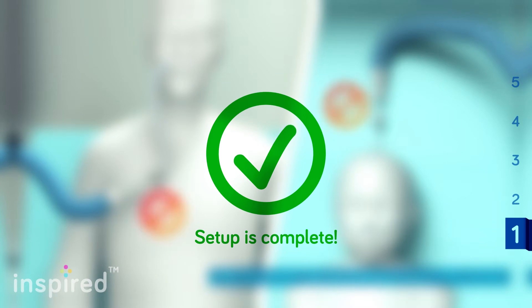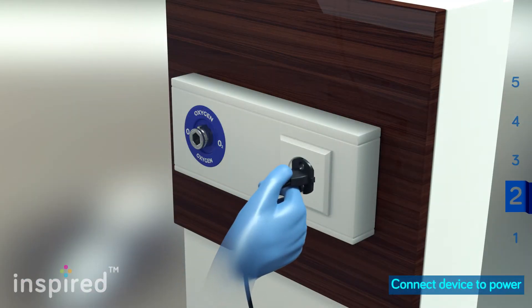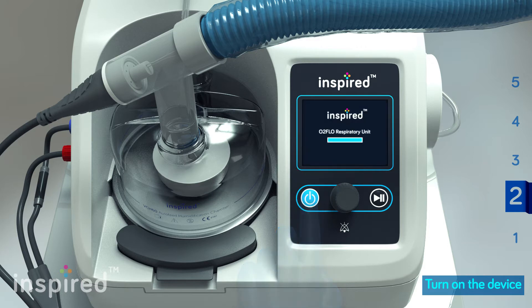Setup is complete. Plug the appliance into a power socket. Press and hold the power button for two seconds to turn on the device.